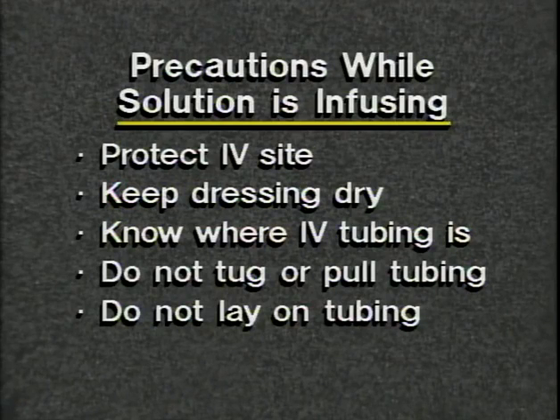The patient should not lay on the tubing. This could cause obstruction in the flow. Let's take a minute to look back at John Sr. in the hospital. In the 60s, there were no infusion pumps, and problems in care delivery were numerous.